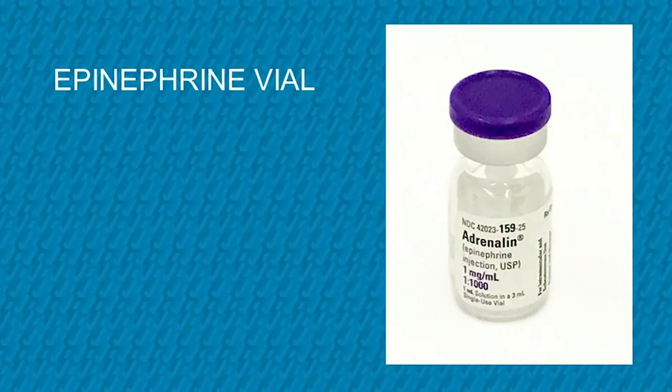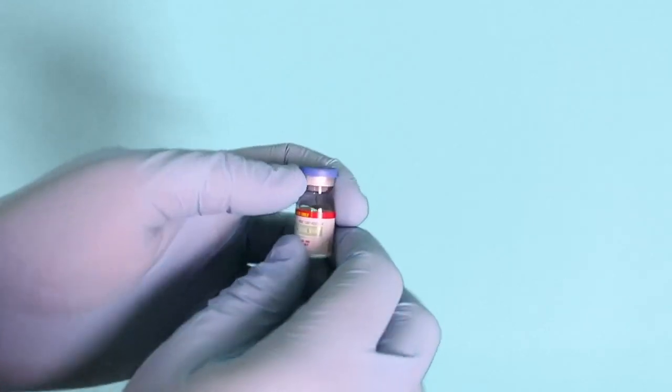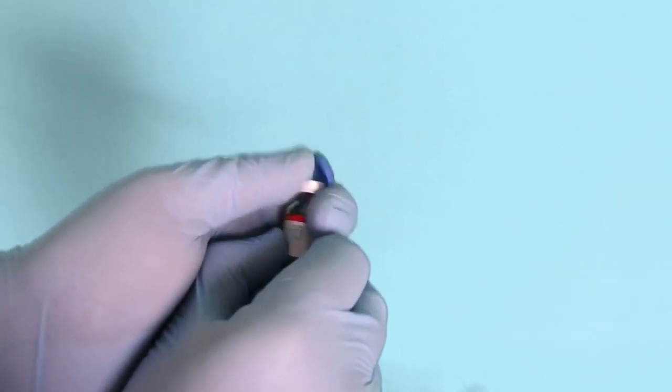First let's talk about the epinephrine vial. The epinephrine 1-1000 1mg 1ml vial is covered with a plastic dust cover that must be removed prior to inserting a needle. The first step will be to remove it like so.